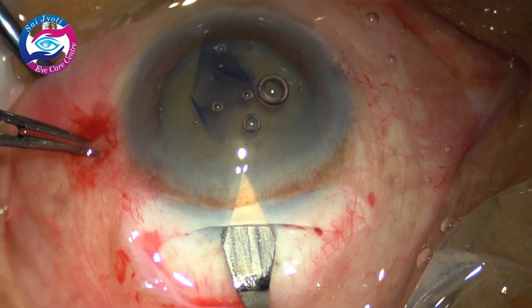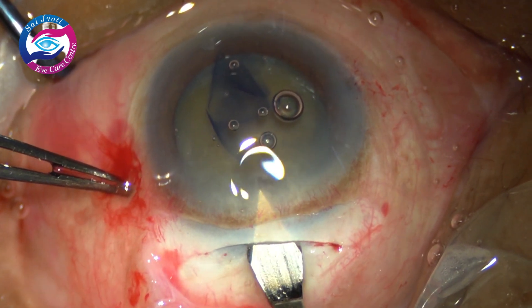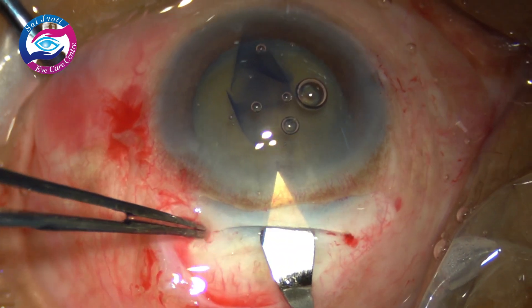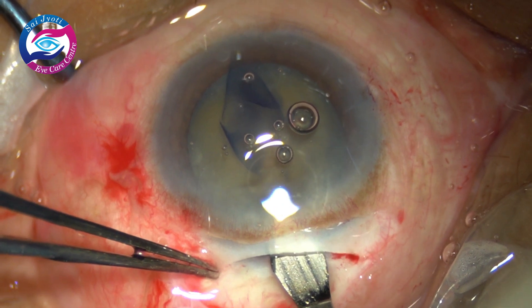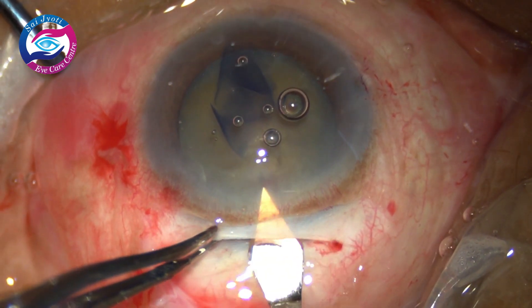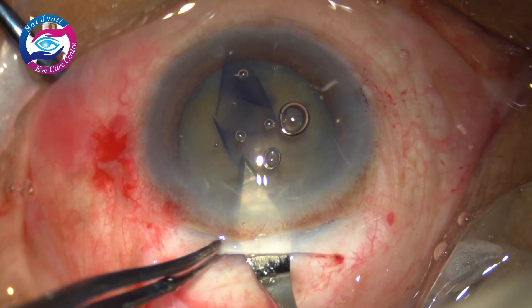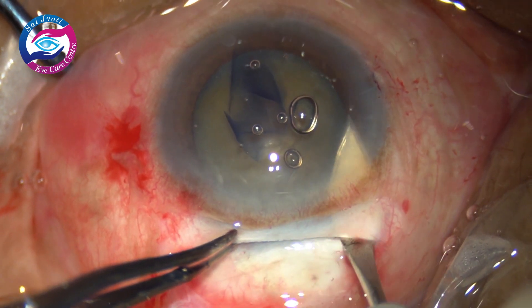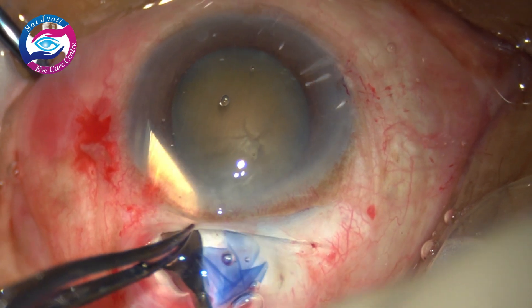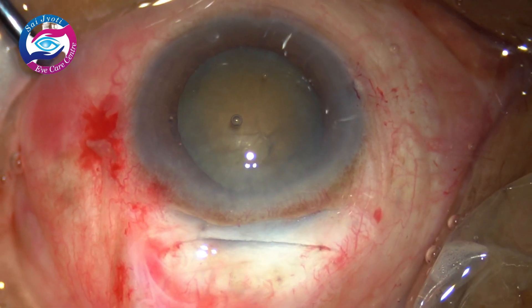Now I am opening the tunnel. A 2.8 mm keratome is used; the blade is dimpled down into the anterior chamber after marking the inner lip, and similarly it has been opened while moving forwards. This is how we make the scleral tunnel.